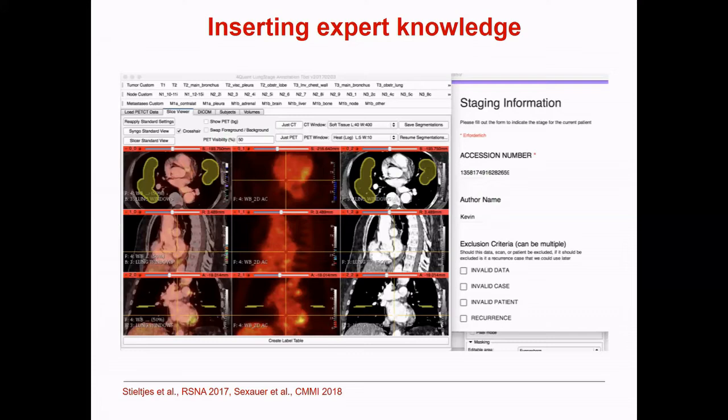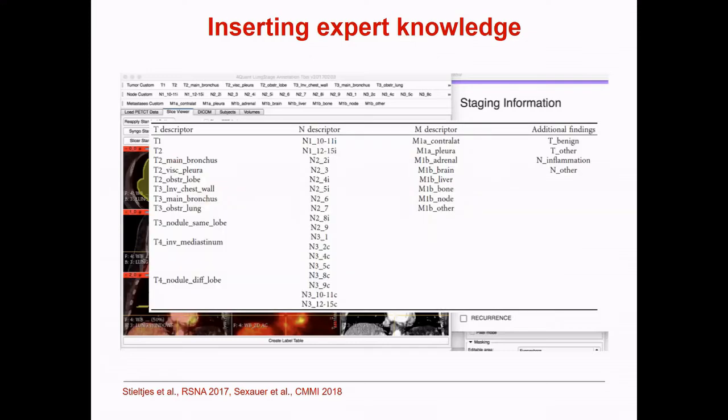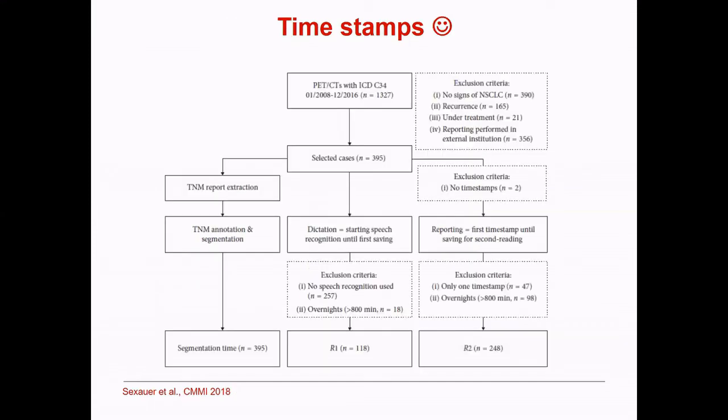And then of course people say, well, if I read it out, then I'm much faster than you are, right? So this is again all the different labels that you would require to describe the case, and we put them in the GUI. What we basically did is we measured how long people took while doing this.